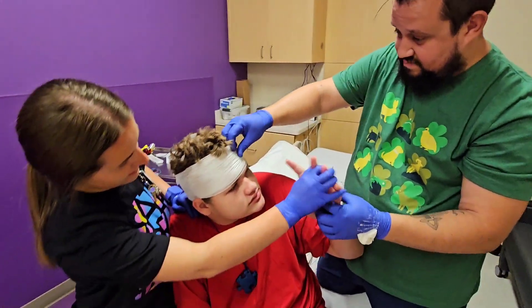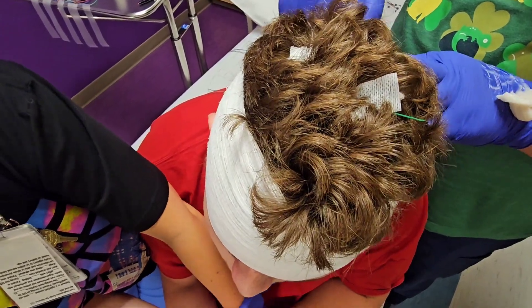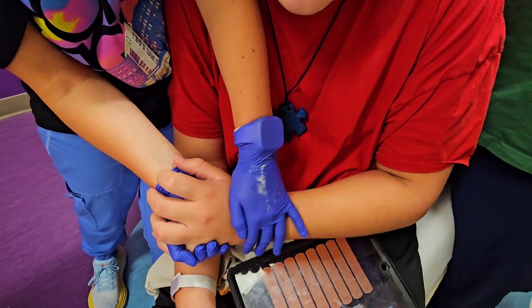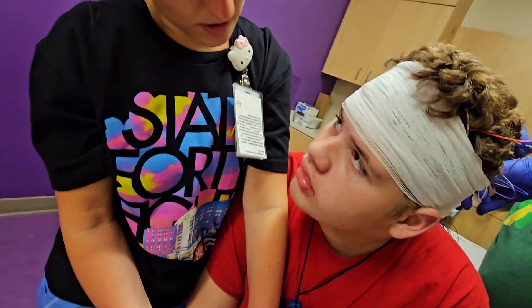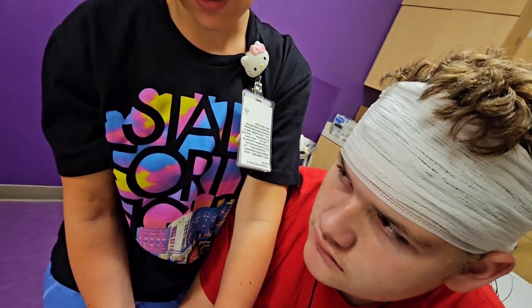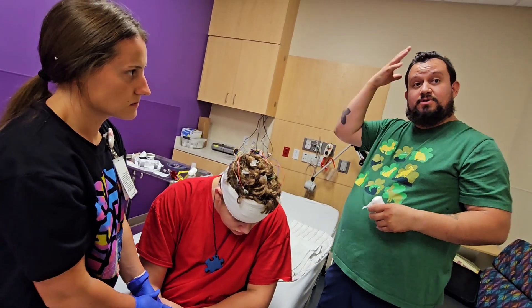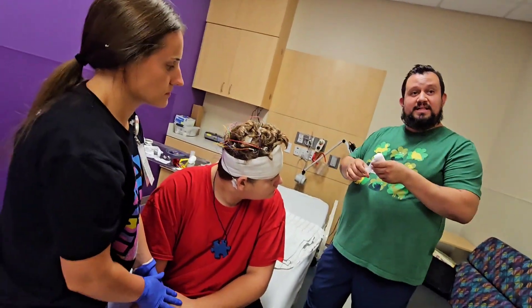Can you hold my hand? Hold my hand — it's gonna be okay, he's a good boy, we're gonna be okay. You can do another big hug after they're done Bubba. Yeah, you can hug me if you want, it's gonna be okay. Hold my hand, okay — see, another one right here, one, two, three. Where's our music? Play some music Bubba, you're doing good. Good job JJ — yay! You got about half of them on so far — everything's on, all of them, wow, where they're supposed to be. But they need to be cleaned more and some are just floating, so I'm gonna add a wrap and then we'll go back. Hopefully it'll press them down where they're supposed to be, and if not at least it keeps them in place.